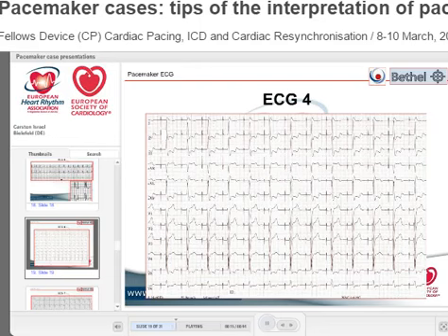That is something I see sometimes in patients with CRT. CRT devices do not understand AV junctional rhythm at all. They do not pace, or if they pace, they do very stupid things. So again, program higher, make an overdrive, then you have normal AV sequence, which is helpful for the patient.